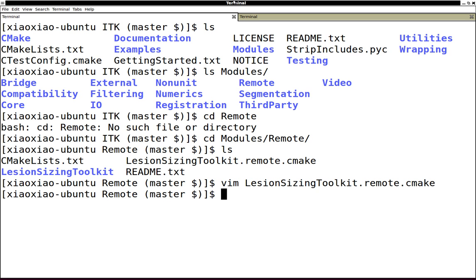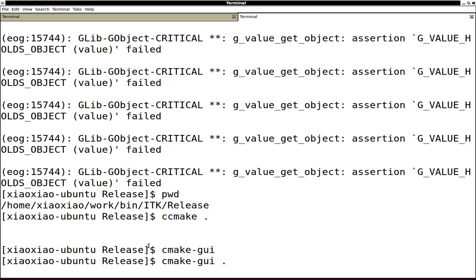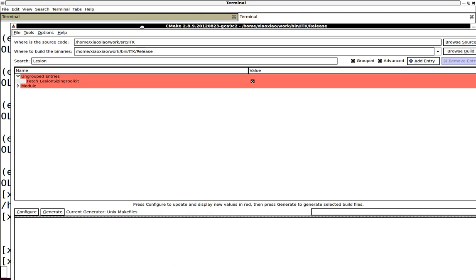To use it, you simply go to your ITK build tree. Let's look at the configurations I have right now.